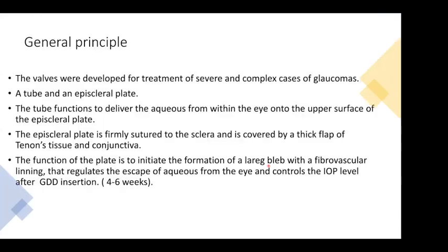So what happened recently? A few years ago, I started to feel a desperate need for the valves, as I'm facing cases which are suitable for valve implantation. I have also seen that cycloablative procedures are quite good, but you might need a lot of repeats, and there is a lot of debate in case you have an eye with very good visual acuity. So I felt a need to improve my abilities in the valve procedure.